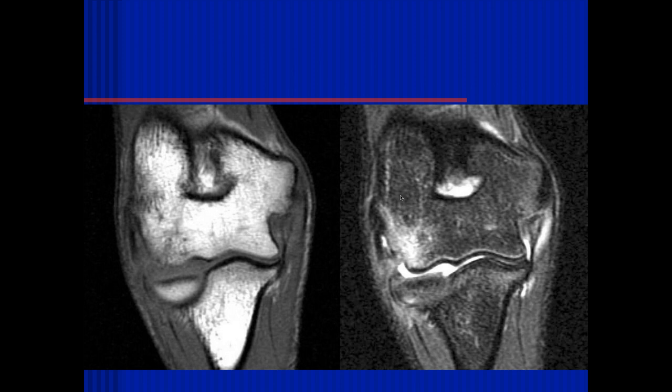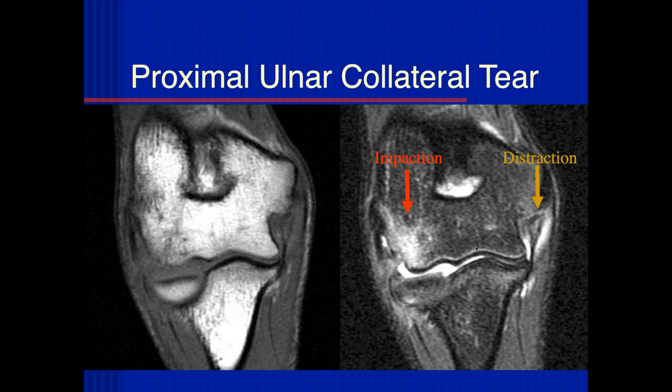Here we can see some increased signal intensity within the proximal aspect of the ulnar collateral ligament, some slight cortical irregularity and surrounding edema and fluid. I'm not sure if this may also be a traction injury or if there could be an ossific fragment. There's an impaction or acute trabecular injury in the medial epicondyle. This is a typical valgus injury to the elbow, and this is more acute.